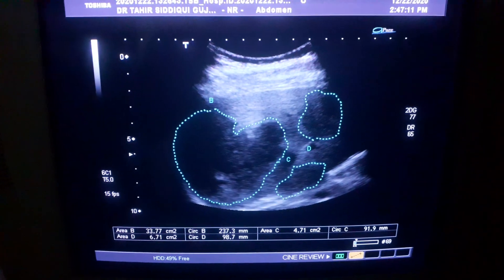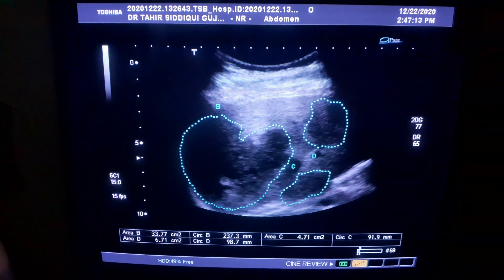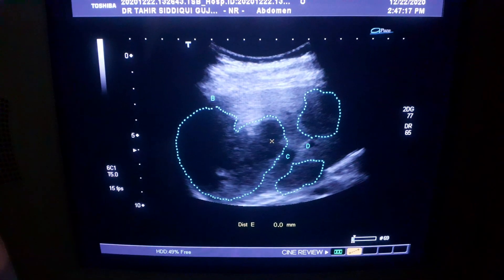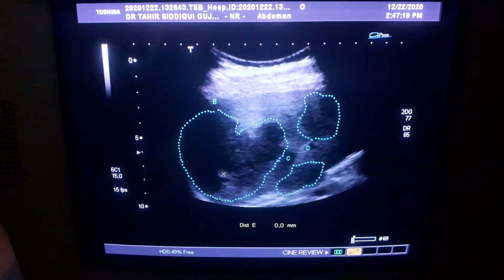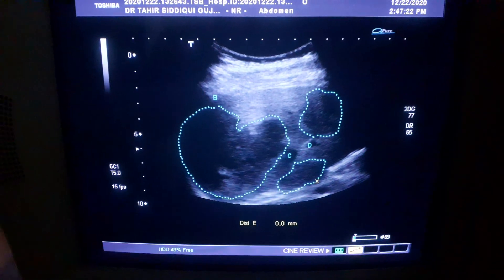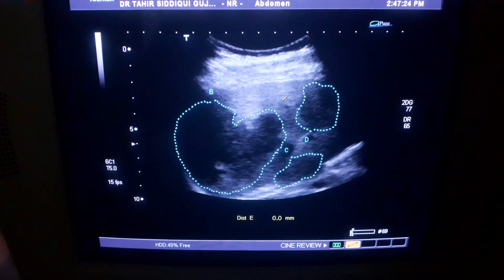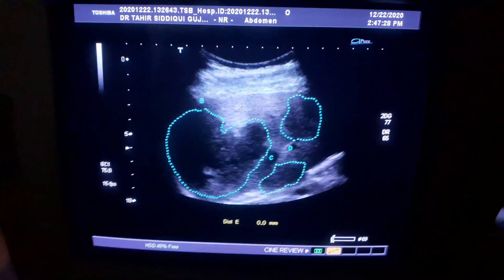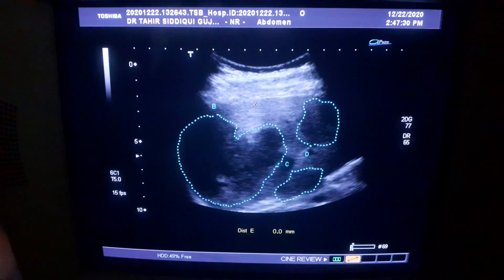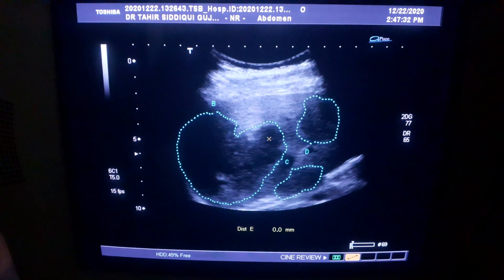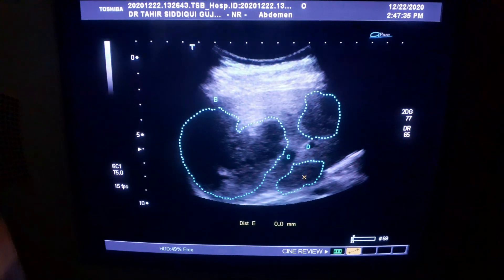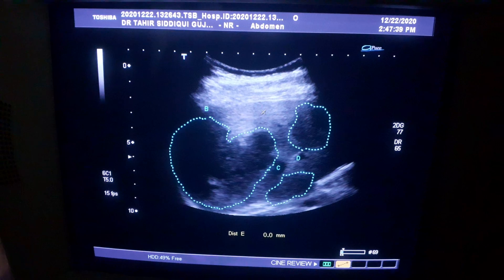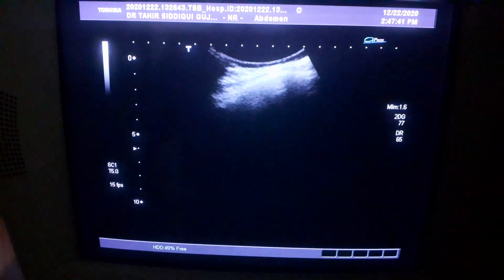These areas are in fact focal fat-spared areas. That means these are areas of the liver in which fat is not deposited to the extent it is deposited in the fatty areas. That region is showing fatty infiltration. So this is the normal parenchyma, spared from fat, while this is the area in which fat is accumulated more than normal.